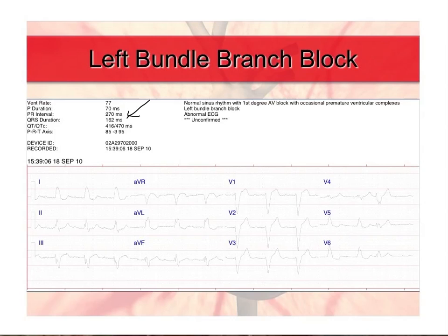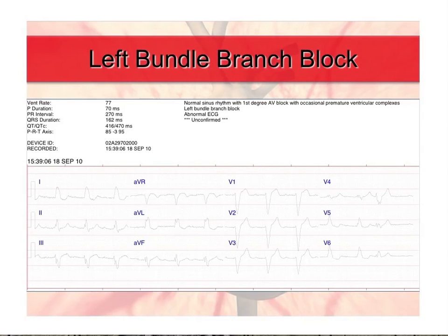Look at the QRS duration here. Remember, if you have a wide QRS complex, you're thinking of only a few things: a supraventricular rhythm with aberrancy, a ventricular arrhythmia, or hyperkalemia. We have a wide rhythm, we do have P waves, and they are married to the QRS complexes. We have a regular — though prolonged — PR interval of 270 milliseconds, so there's a first-degree AV block. It is a supraventricular rhythm with aberrancy.